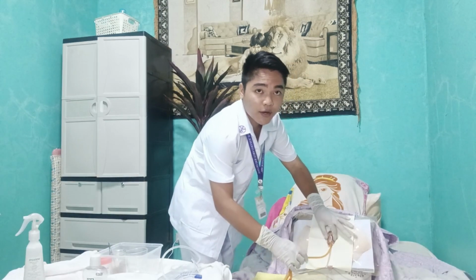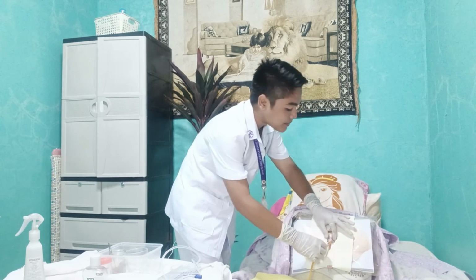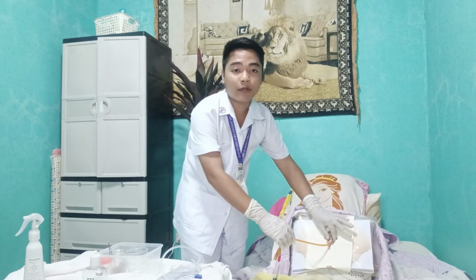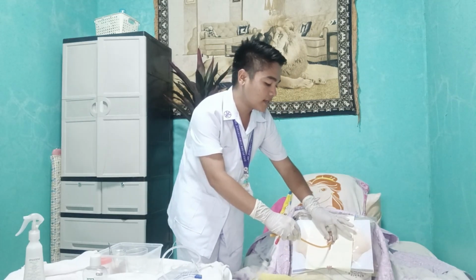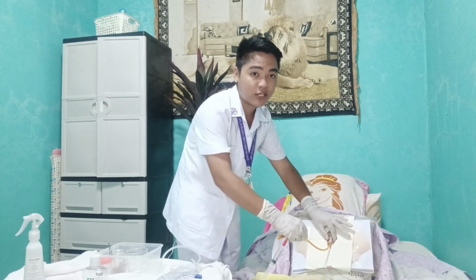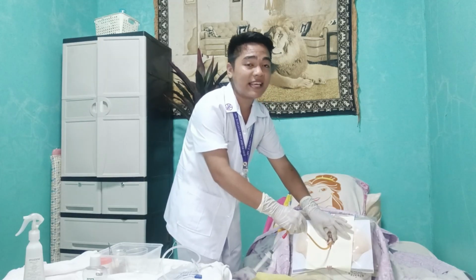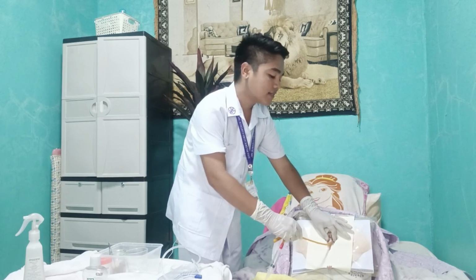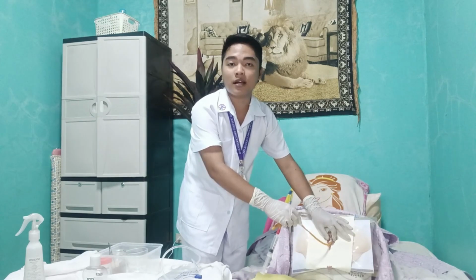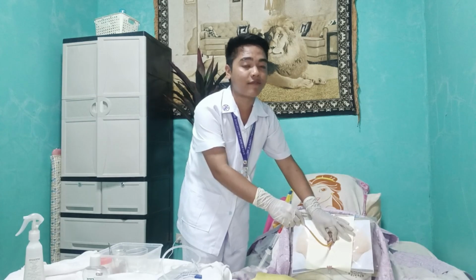Let's insert properly and check. Kindly please relax, ma'am. Thank you so much. Now insert the urinary catheter about 2 to 3 inches. Relaxation of the external sphincter aids in the easy insertion of the catheter. Insert the catheter into the meatus for 2 to 3 inches or until urine begins to flow. The female urethra is approximately 1.5 to 2.5 inches.